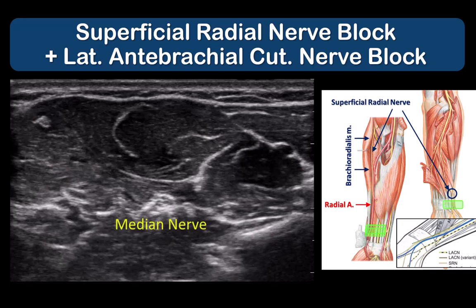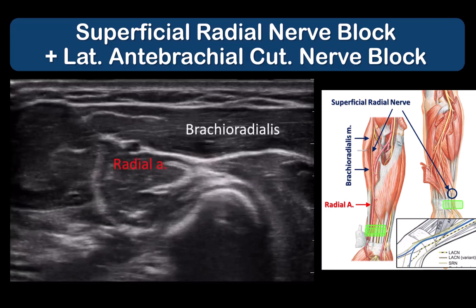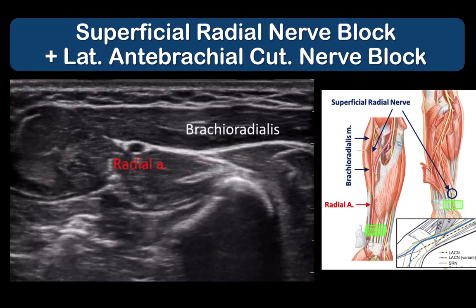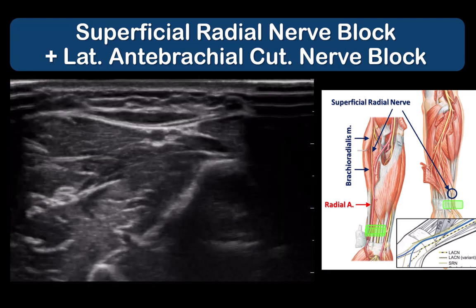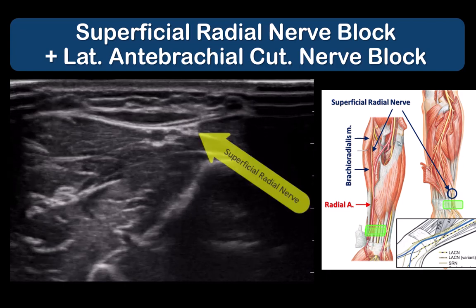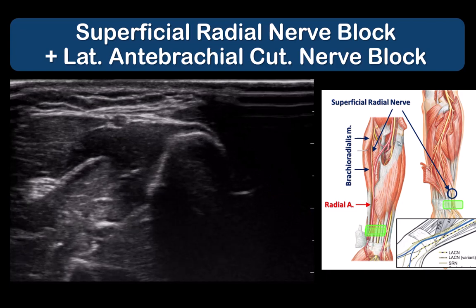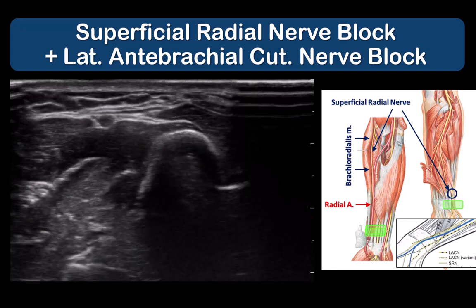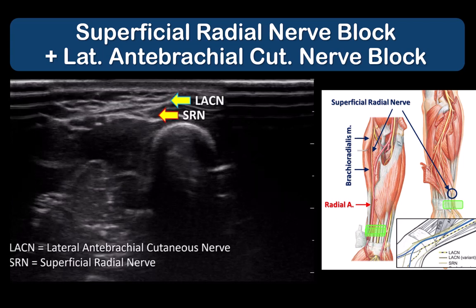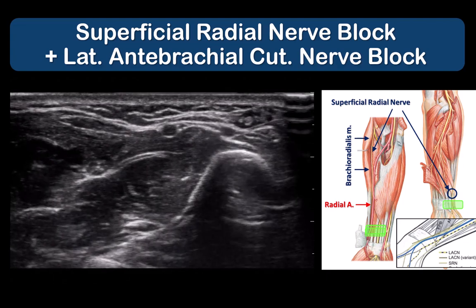Slide the probe distally towards the wrist and the nerve usually reveals itself as a sliding structure that rises up from under brachioradialis towards the artery. Inject carefully in the plane of the artery and nerve.